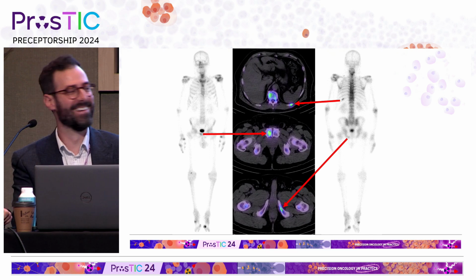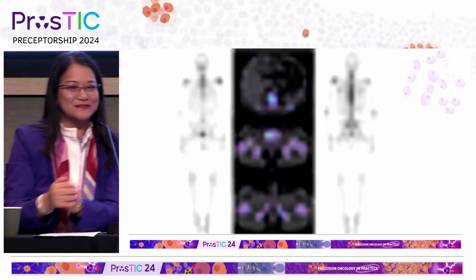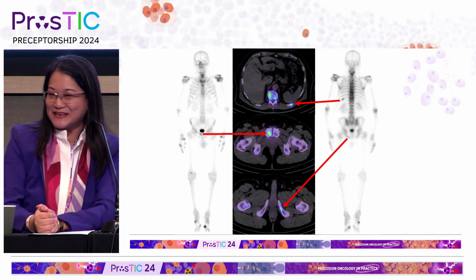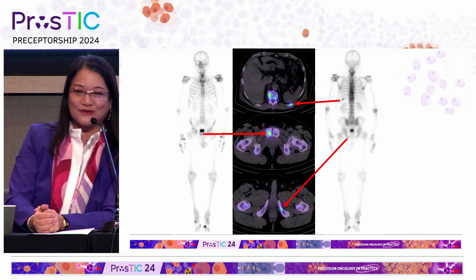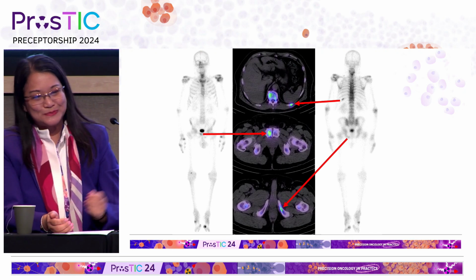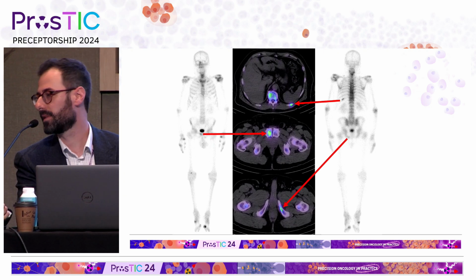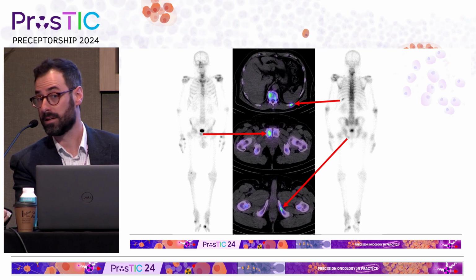This is taking it to that next level of challenging when it comes to interpreting bone scans, despite the presence of a SPECT CT. So would you like to tell us what it should have shown? Oh, well, here we go. A little crisper now. So you do see 3 mild sites of uptake. On the planar, a little hard to make them all out. You can see them a little bit better on the SPECT CT.